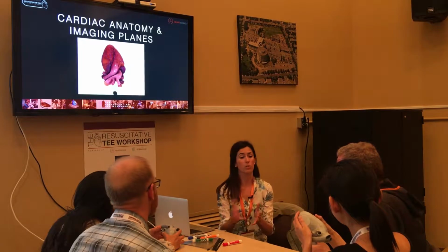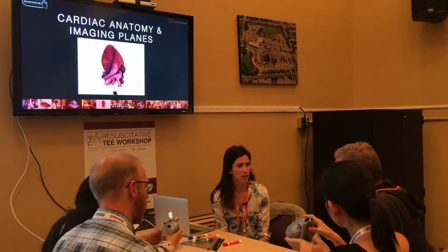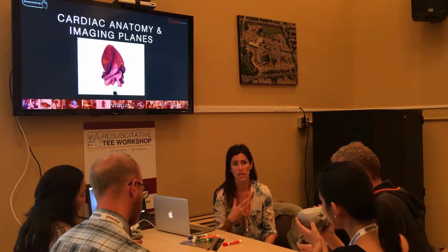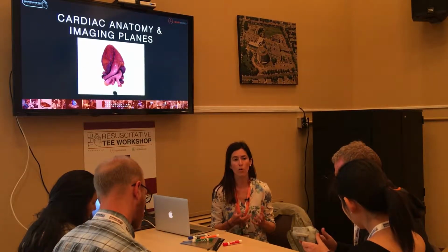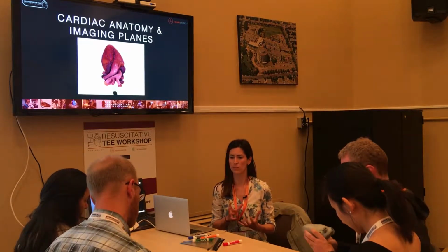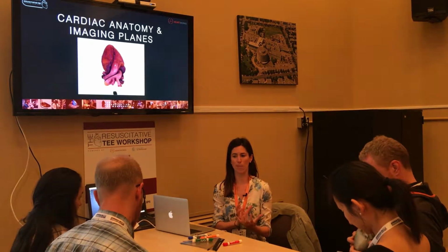Okay, so what I want you to do, I want you to start out with, is everyone has their heart. They are 3D printed hearts cut in one of the 4 resuscitative TEE views. So each one has a different slice there. I want you to hold your heart in the anatomic position in front of your chest, as if someone like Indiana Jones pulled your heart straight out of your chest. How would it kind of come out in front of you?